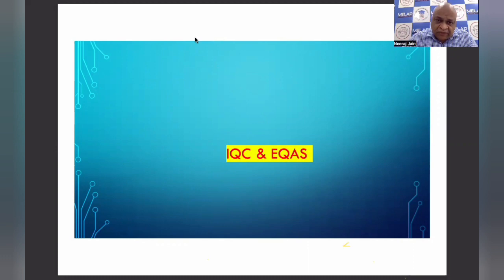Why are we running IQC in our lab? What is the purpose of running IQC? Sir, to ensure the consistency of our analytical process, day-to-day testing process, as well as to ensure that our test results are reliable to be released for use for patients.